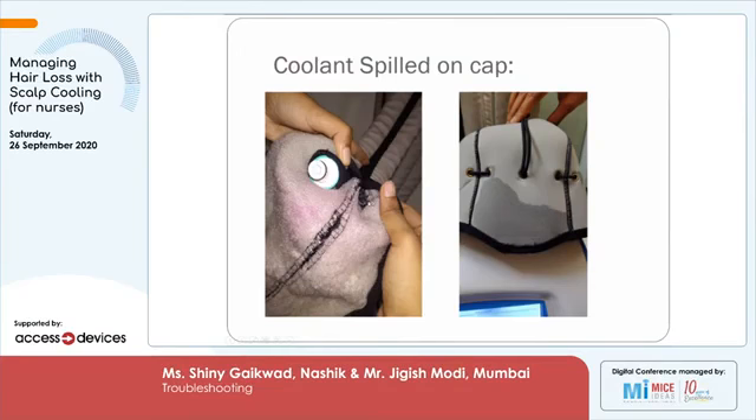Please do not switch on the machine and kindly call the engineer. Where the mouse is near the thumb, you can see the tubing which is ruptured. On the right side, you can see the cap is ruptured and it has caused a massive leak in the cap.